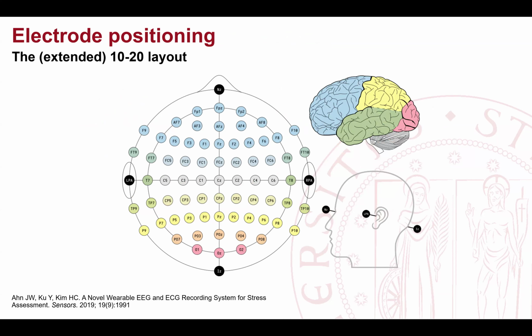This one as a reference. So it's not necessarily a channel. Ideally, it would be a neutral channel. Normally the earlobe or the mastoid can be used as a reference, because there is bone, so for sure there is no EEG activity, and even in the earlobe there's no EEG activity. That's why it's an ideal zero level.